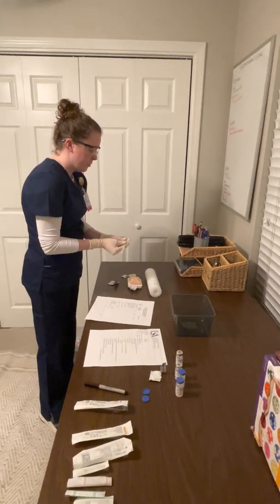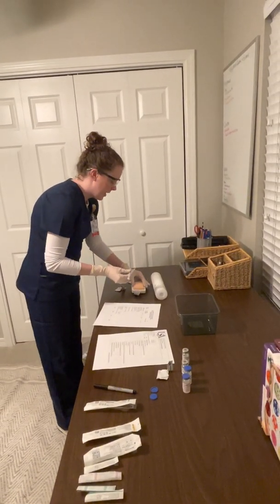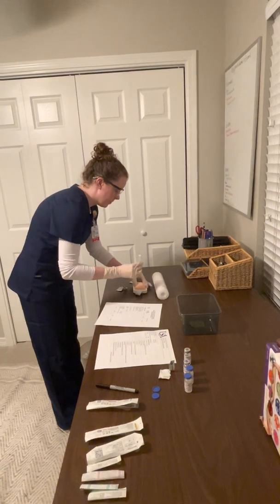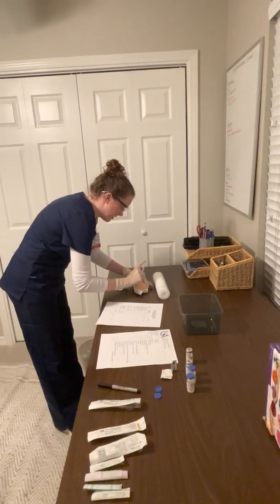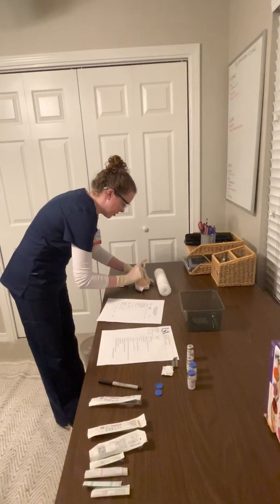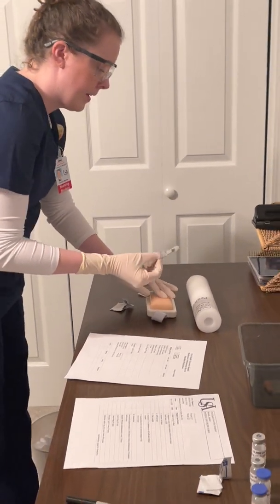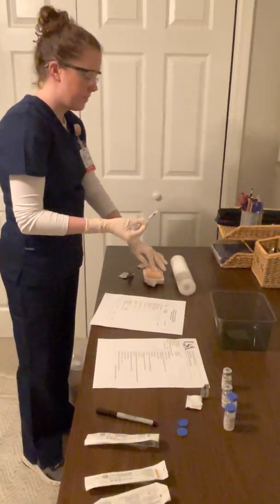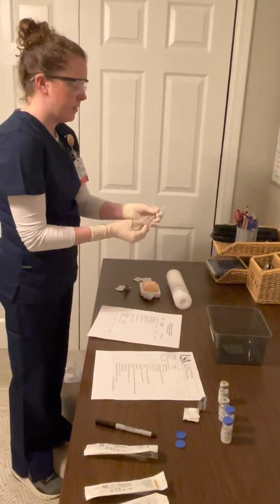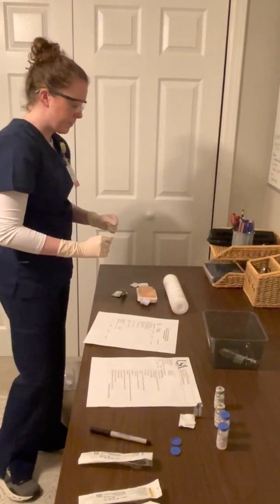So I would pull back on the safety of the syringe, pinch the skin, go in at a 90-degree angle and inject the medication slowly into the patient's abdomen. After this, I would apply pressure, but not massage the patient. And I would also cap my syringe and put it in my sharps container.